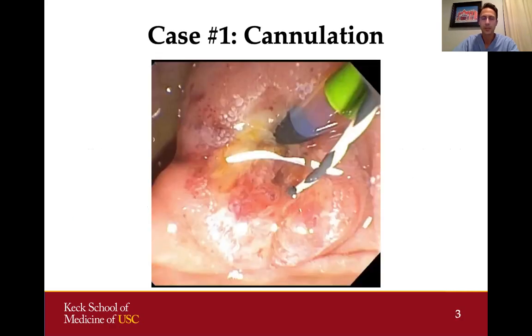Initially, the first thing we need to do is get into the bile duct. Here you can see that the ampulla is on the rim of a diverticulum, which always makes things a little bit more difficult and complicated. There was a lot of edema, and the bile duct was a little bit covered up by the tissue at the upper aspect of the papilla, so we kept ending up in the pancreatic duct.